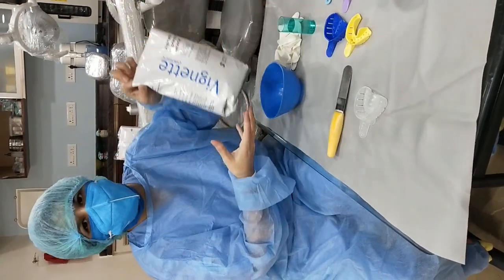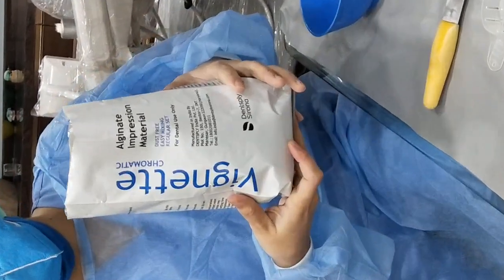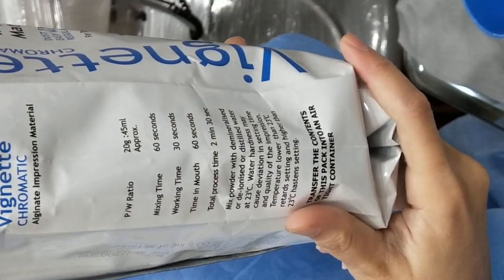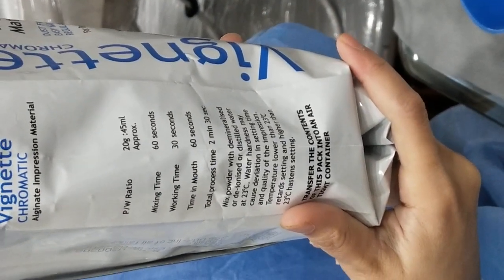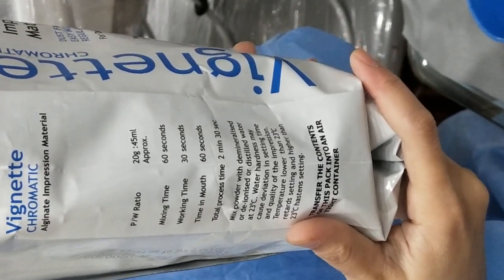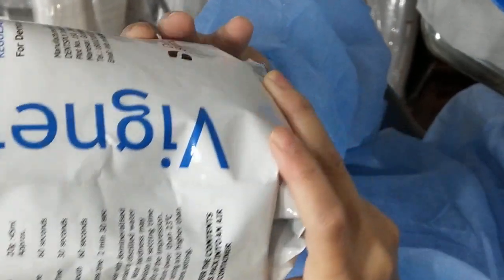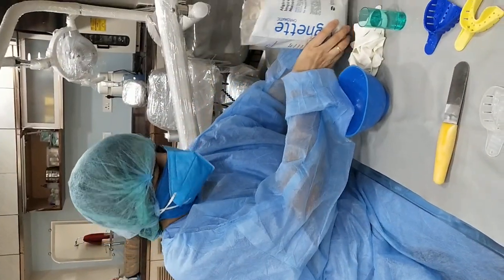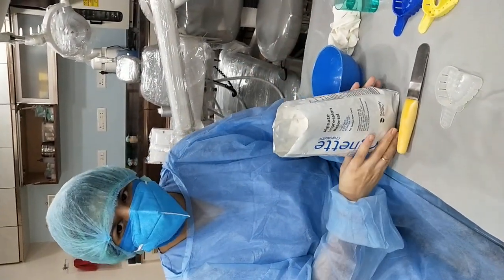As you all can see, the packet says that the powder to water ratio should be 20 grams to 45 milliliters, that is, approximately one scoop of powder to the lower marking of the measuring cylinder.